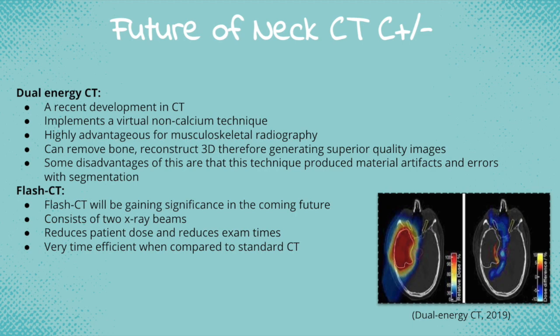Future of neck CT. Dual energy CT was something that we found was a very recent development in CT. It is also known as spectral CT, and it is a type of CT technique that uses 2 separate X-ray photon energy spectra. Essentially, it is called a virtual non-calcium technique, but it uses the interrogation of materials that have different attenuation properties at different energies, whereas conventional single energy CT only produces a single image set.